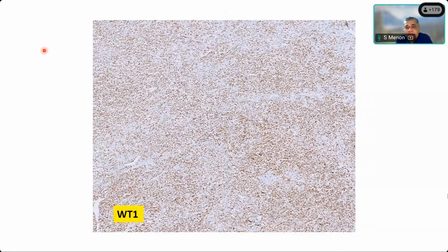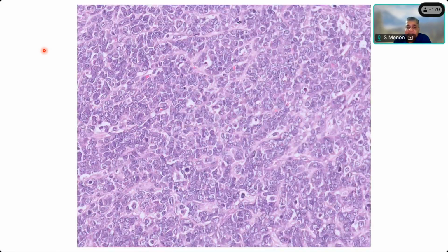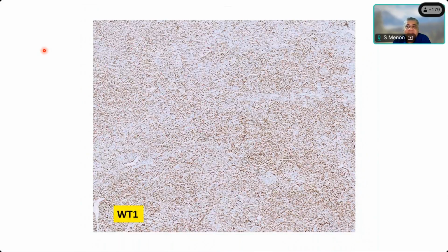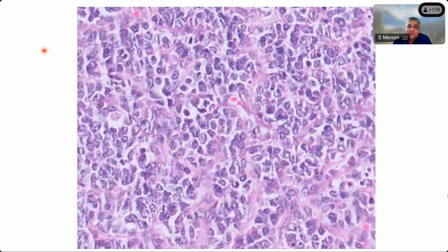So this tumor was WT1 positive. Now, what do you think? Is it serous carcinoma, WT1 positive? Shweta, you know of tumors which are WT1 positive in the ovary? Richa says it's a DSRCT. So Richa, you did not see any desmoplasia in this at all. Hardly any desmoplasia. But yeah, DSRCT is a good thought, not bad, because we did think of round cell tumor in this. Swati says she can see Call-Exner bodies. Now that would be a little more imagination, I think. We really don't see Call-Exner bodies.